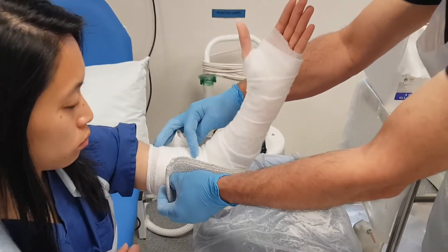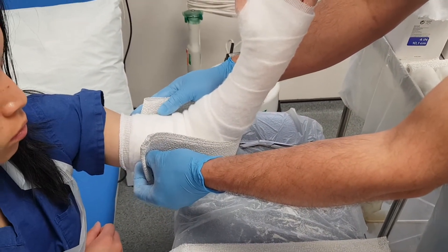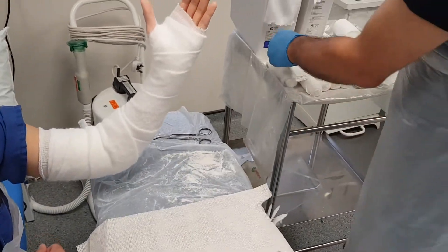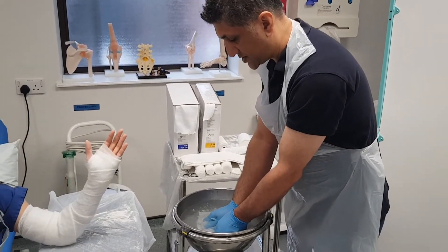We've got our U-slab which is going to be going in the other direction. We want to leave some space at the front so that there's room for expansion if there's any swelling, so that we don't get a compartment injury. I'm going to dip this in the water, which is about just over room temperature.